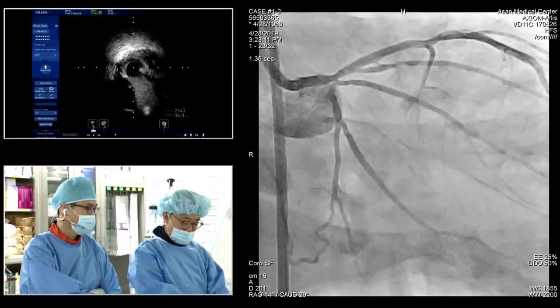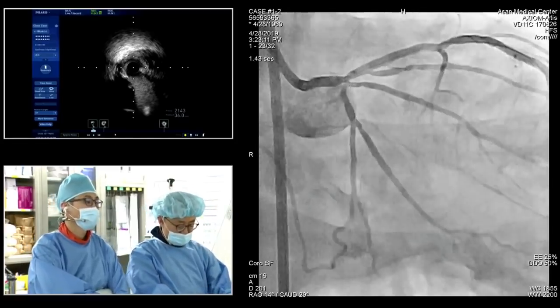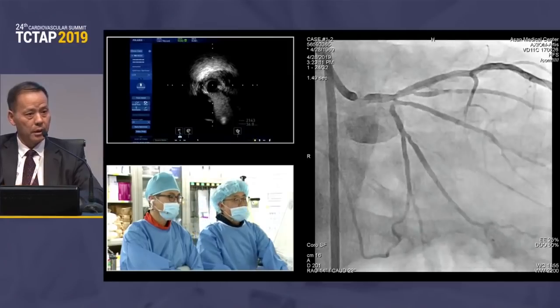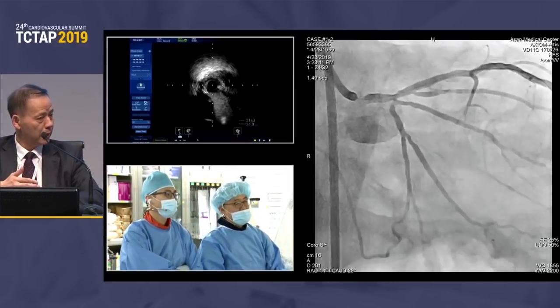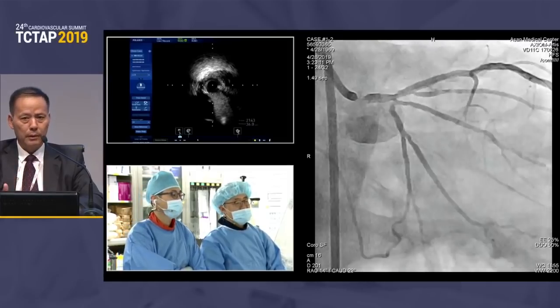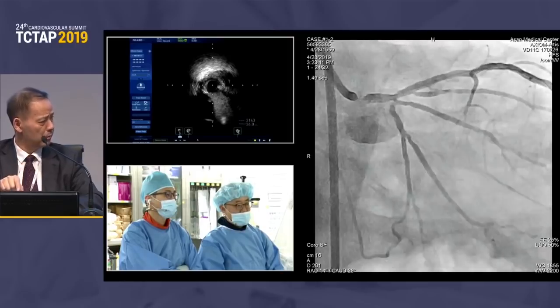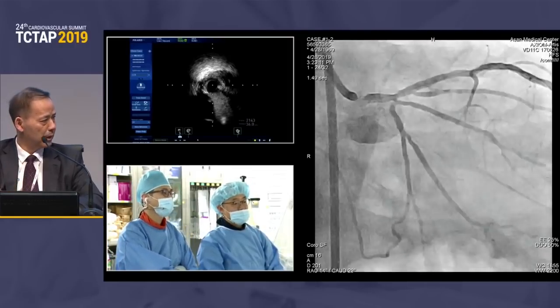But another point: angiographically, the bifurcation angle between the circumflex and left main is unusual. From our DK5 study, we do have some cases of the provisional stenting technique. If the circumflex ostium was pinched too much, we need ballooning, and it will be very, very tough to deploy a short stent into the circumflex. Sometimes the stent dislodges or there is distal dissection. So it depends on the process of the provisional stenting technique.